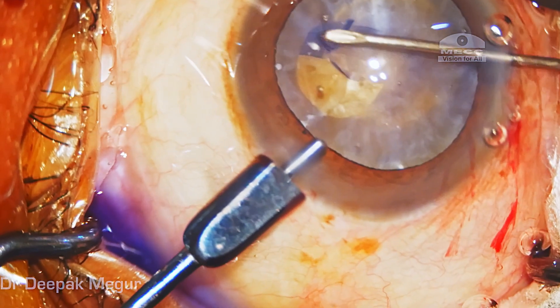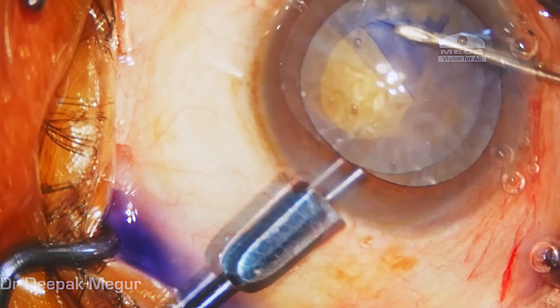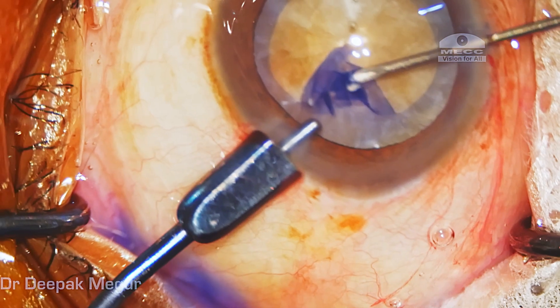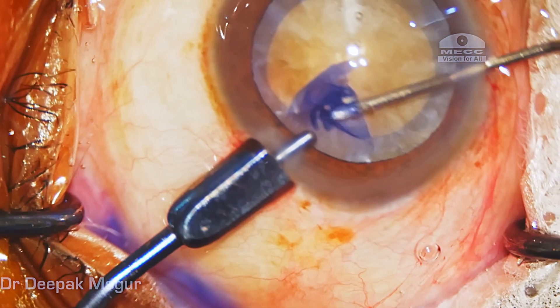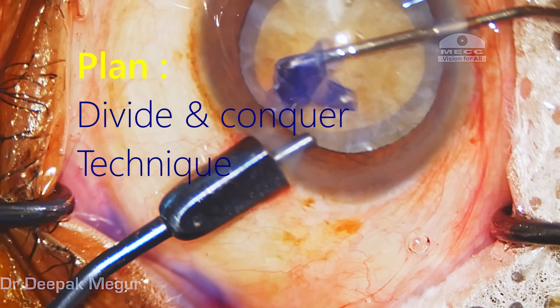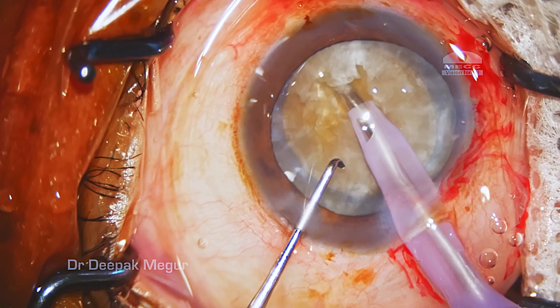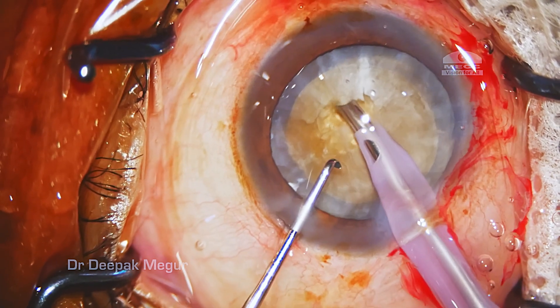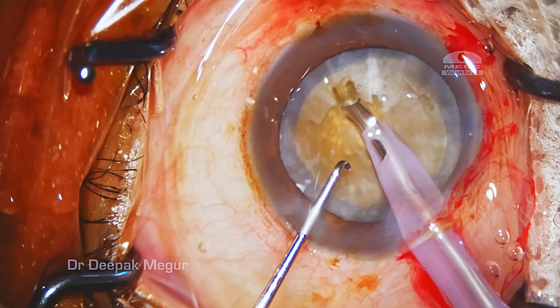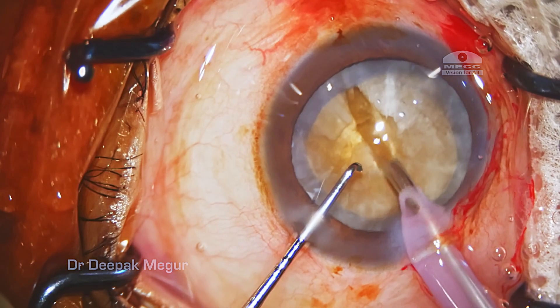Let me take you through one such case being performed by a relatively new phaco surgeon. We can see that the cataract is quite tense and the surgeon has planned to do a divide and conquer four quadrant technique. The rhexis is completed and the surgeon begins to sculpt. His aim is to create four deep trenches which will then be divided into four quadrants before emulsification.